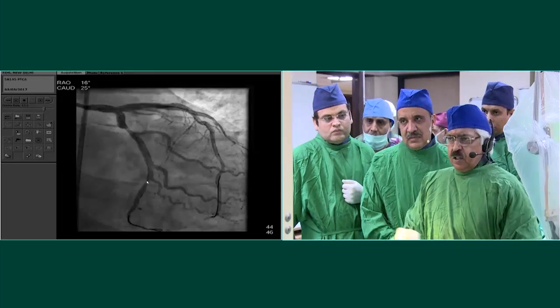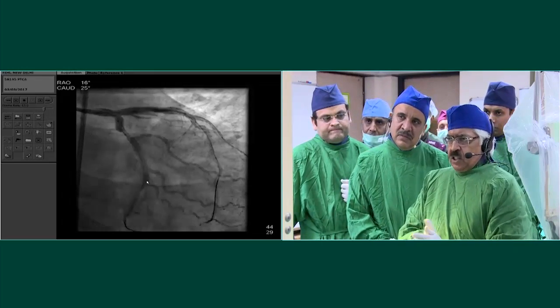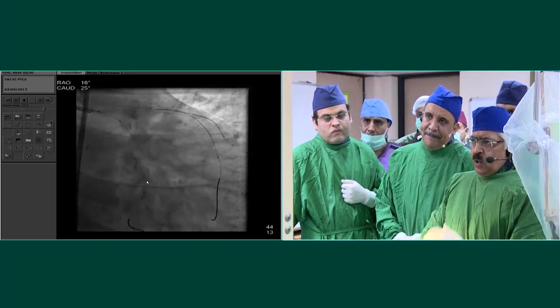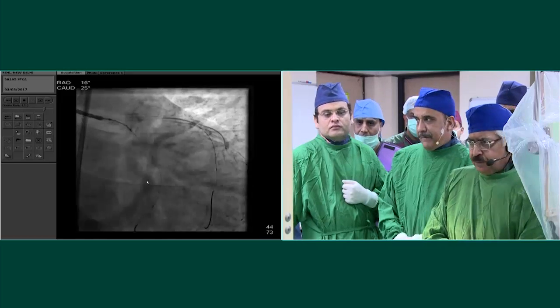I would have preferred to be just a couple of millimeters distal, or maybe a millimeter distal, but at least I know I've covered the ostia. So now OCT is going to tell us what we've done, and I'm sure you're interested in seeing the OCT.